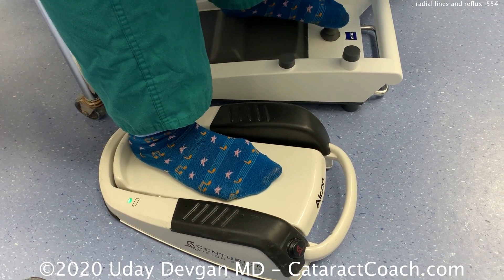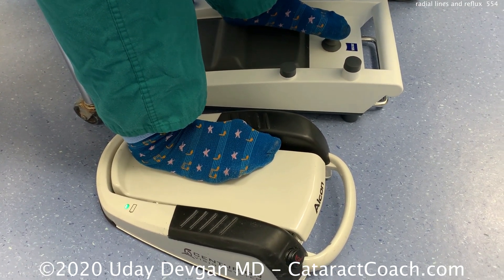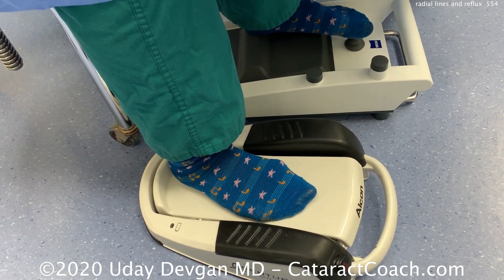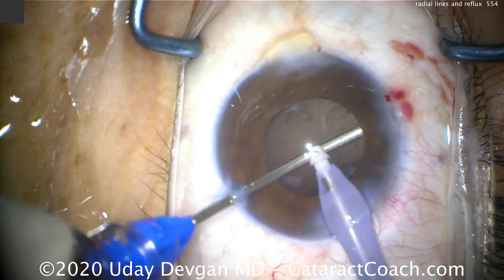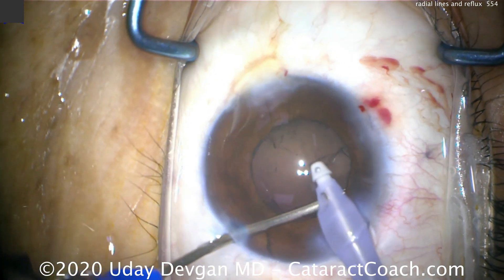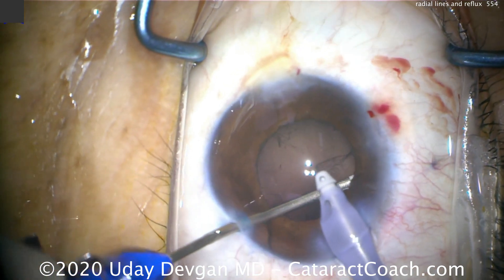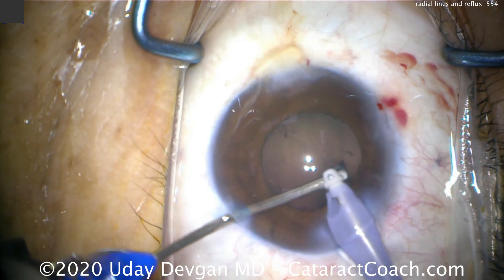Watch it in action: look at the foot kicking over to the left, holding that in position, and then you can go back to regular vacuum and aspiration. We can also do this in bimanual mode — you're not necessarily always grabbing cortex or capsule. Here's cortex removal, but with inadvertent grabbing of the iris coming up shortly — just a quick reflux, let go, and then move back to continue the irrigation aspiration.